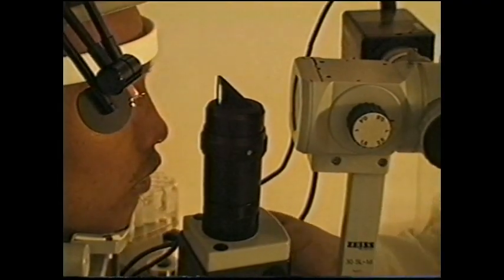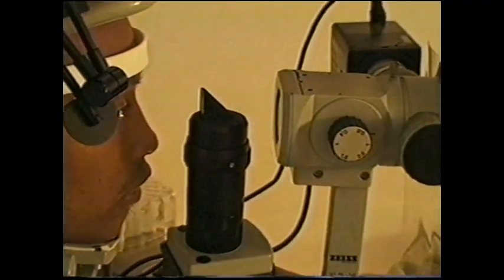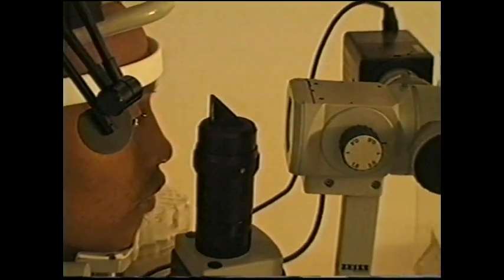The slit lamp is indispensable for the detailed examination of virtually all the tissues of the eye and some of its adnexae. It is routinely used for examination of the anterior segment, which includes the anterior vitreous and those structures that are anterior to it.